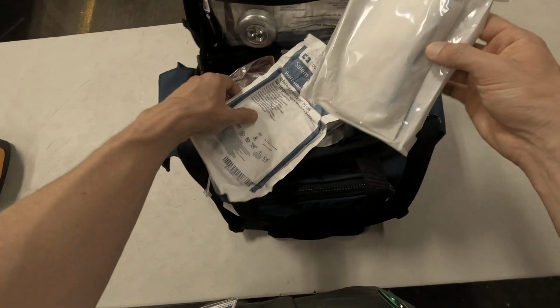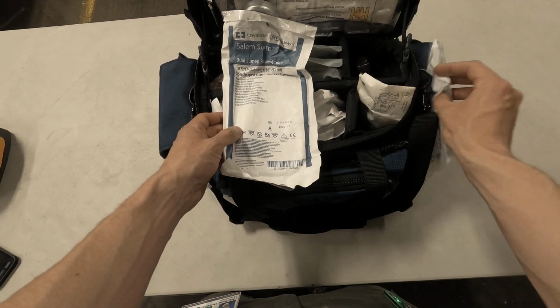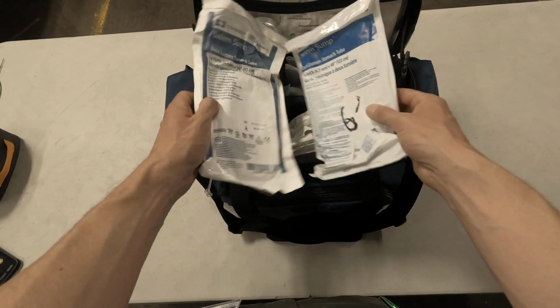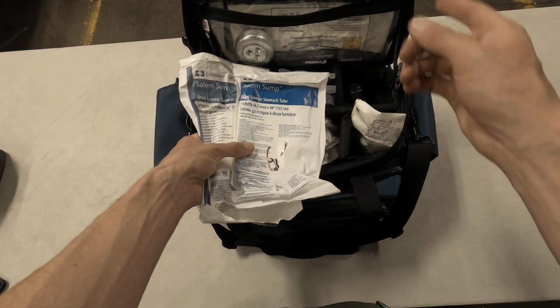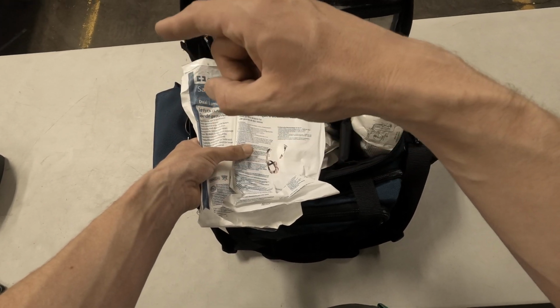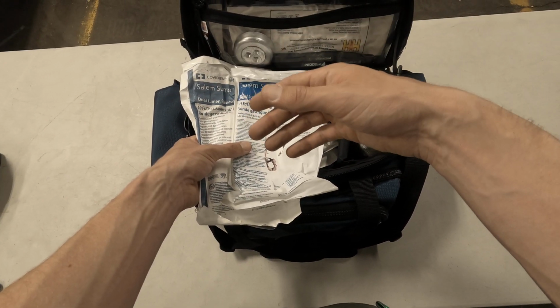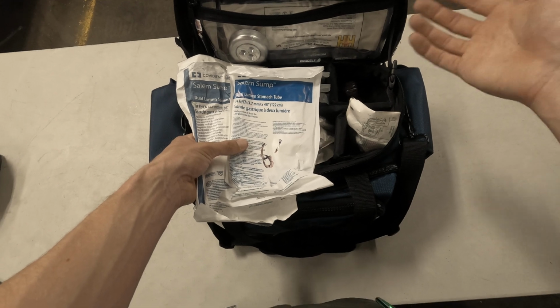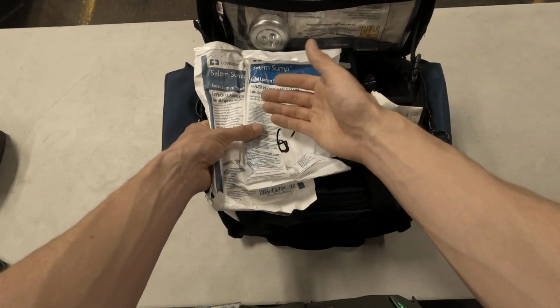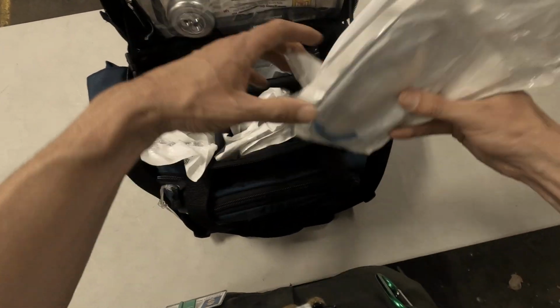These are orogastric tubes. There's plenty of these in the truck and in the airway bag. So the idea was sort of that if we went into a hospital a while back and they were intubated, or they need to be intubated, and you'd do that in the room right there, and they didn't have an orogastric tube, you'd have one available that you can just put right in.